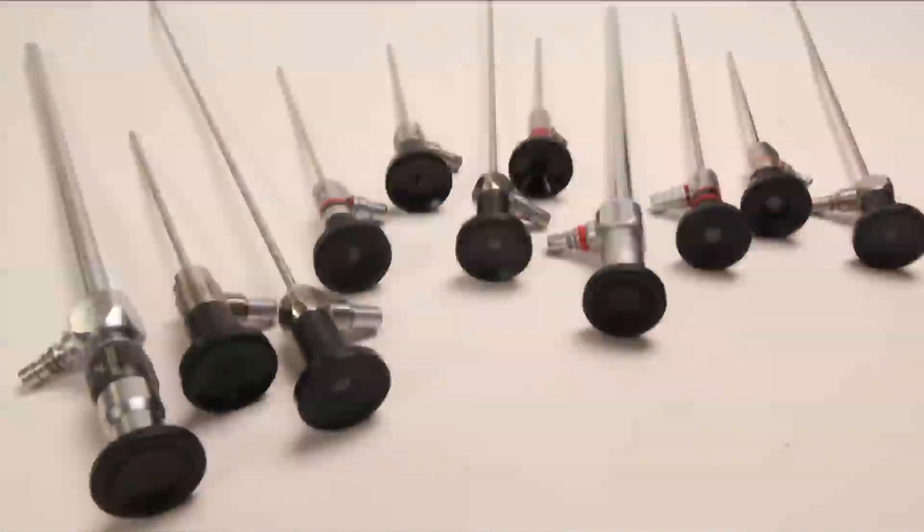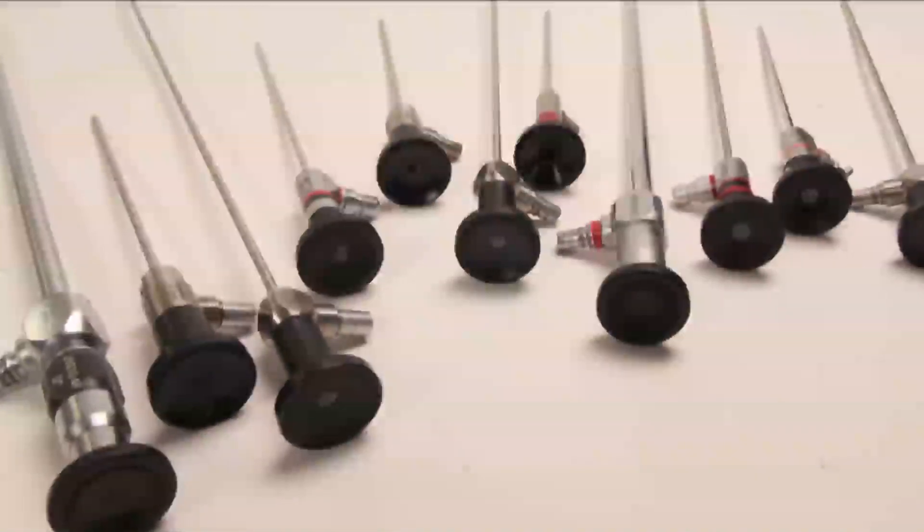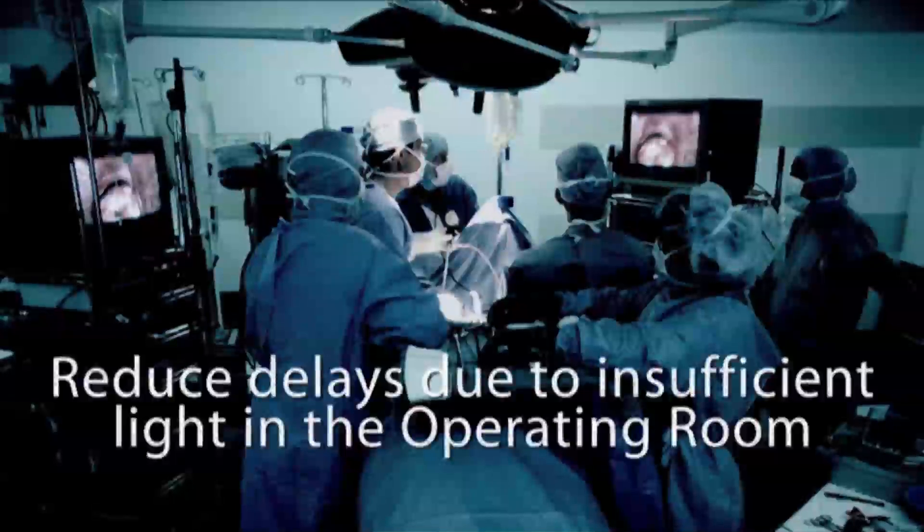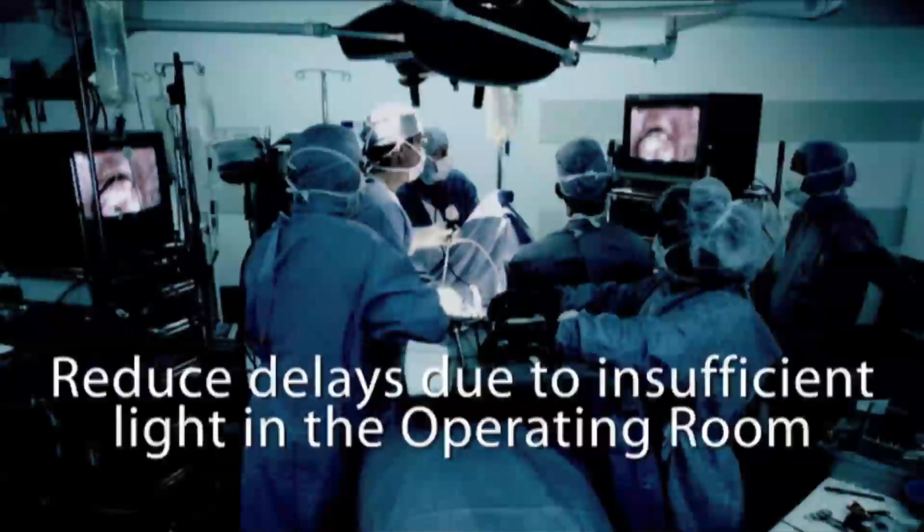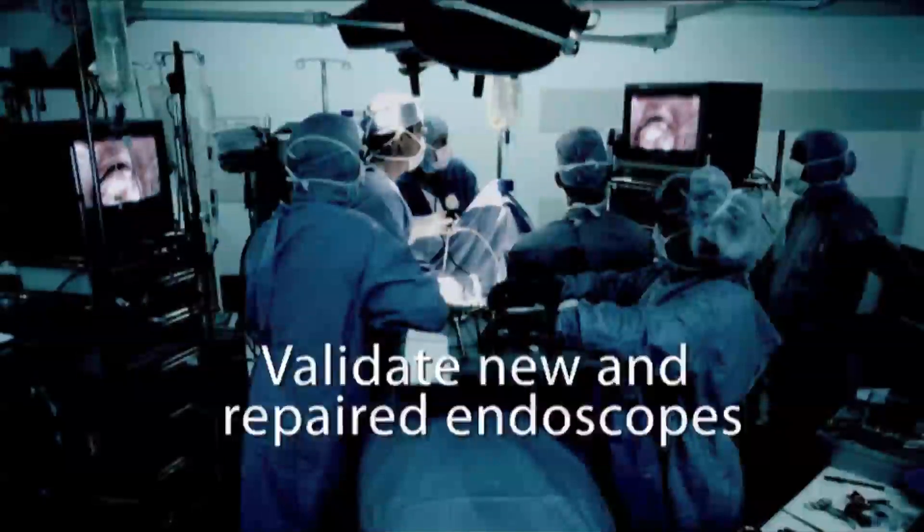Using a patent-pending optical bridge and integrating sphere assembly specially designed for endoscopic systems, biomedical engineers can reduce unnecessary OR delays due to insufficient illumination during endoscopic surgeries.